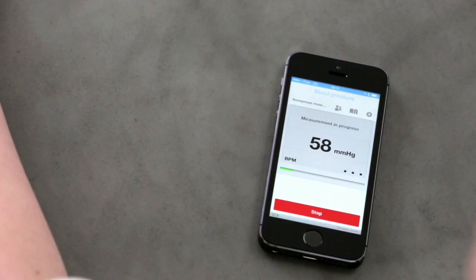Ready? Now simply press the button to start. On your smartphone, tap on the start button to launch the measurement.